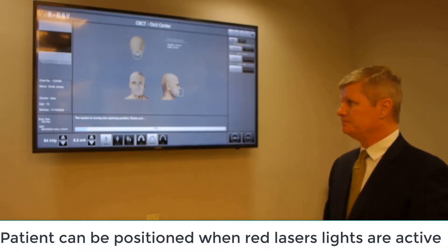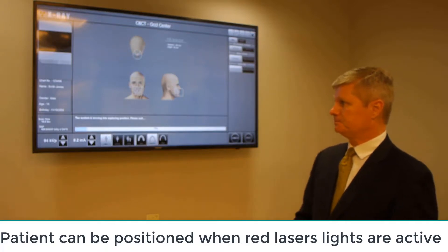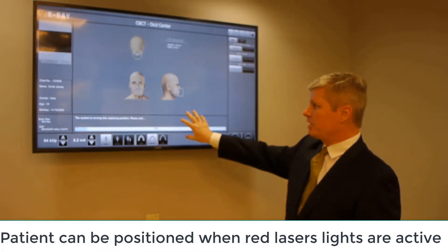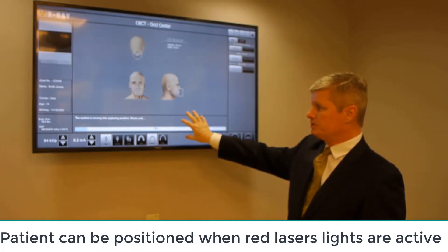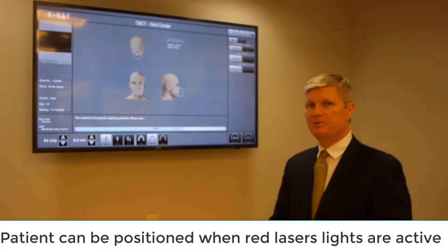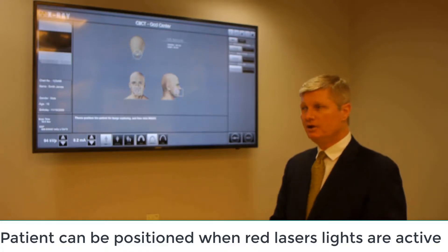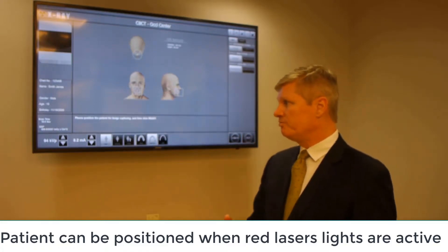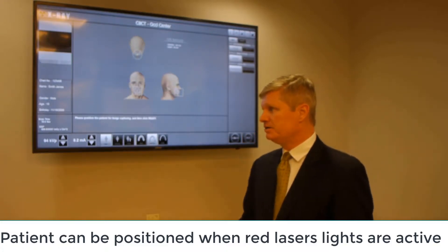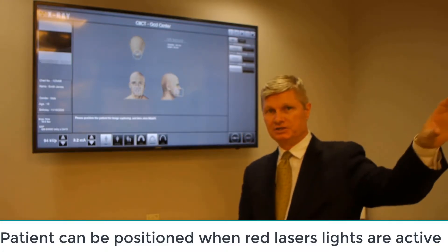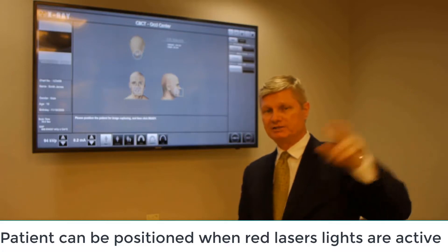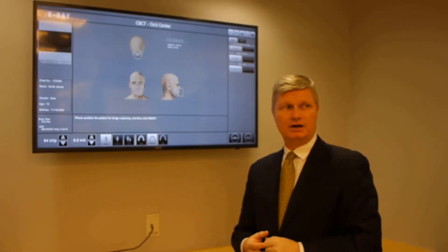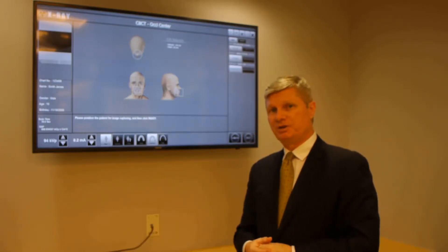Put the device in capture mode. The system is initializing — please wait. You can look at the progress bar to determine when it's safe to put the patient in, but as a general rule, we will hold off putting the patient in until you see the two red lights project on the patient, and we're ready to position our patient.